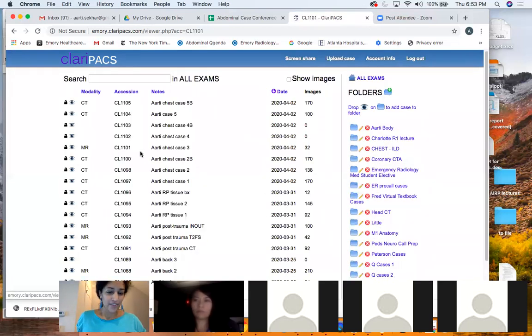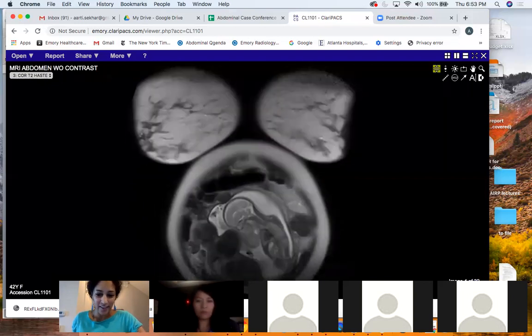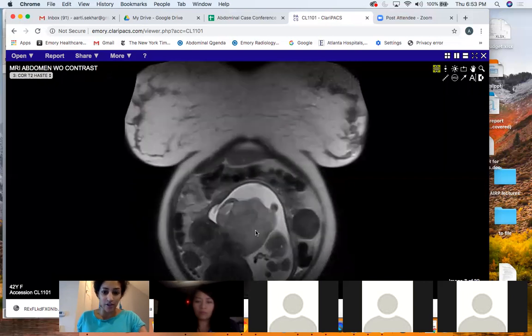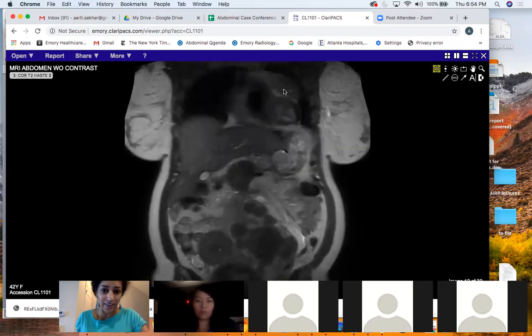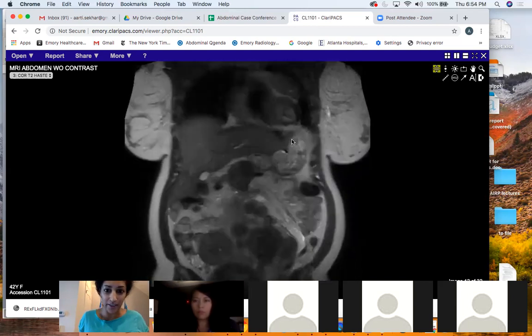This is a companion case. So all 4 of my cases are mediastinal masses. In this case, you can see that the patient is pregnant. So they did a non-contrast MRI. And in the corner of the film, we could see that there was this mediastinal mass. So on the coronals, we actually get a lot more of the field of view, and we could see that there was a fairly well encapsulated mediastinal mass. Had a couple of cystic spaces here. We didn't know what this was.